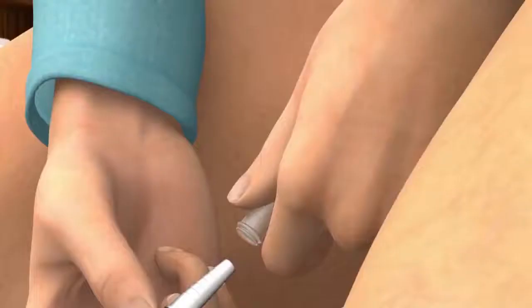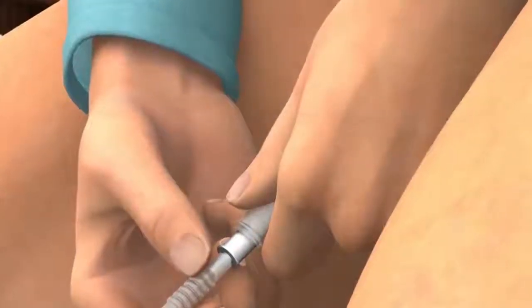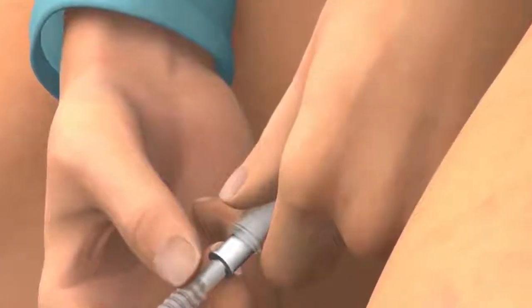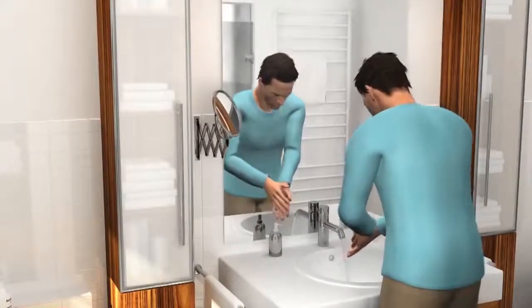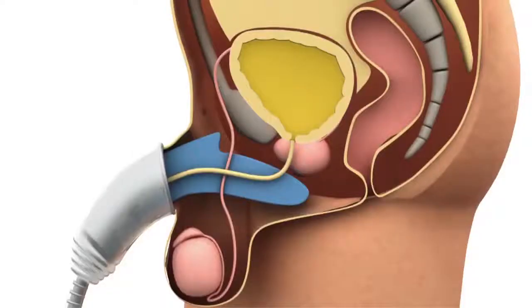Connect the bag to the Urosheath by pushing the bag's inlet connector firmly into the Urosheath outlet. Make sure it is connected firmly to avoid leakage. Finish by washing your hands. A full bladder contains approximately 300 to 400 millilitres of urine. Conveen Active Bag is designed for light to medium levels of incontinence.